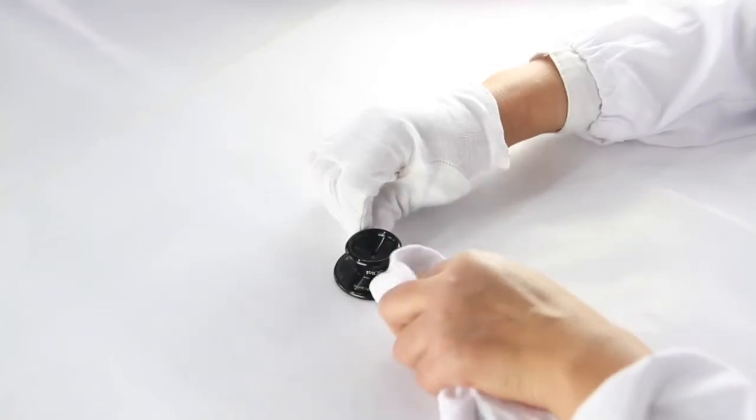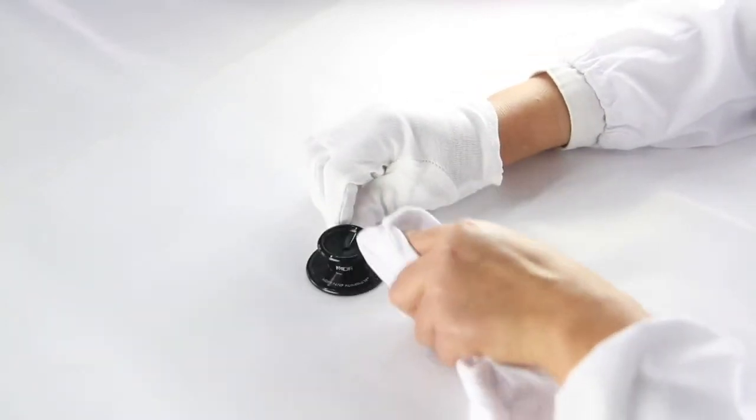Our designers decided to go with the traditional cardiology platform to provide for superior performance auscultation of both high and low frequencies. But at the same time, they made a very significant innovation, which is the 797X's convertible chest piece.